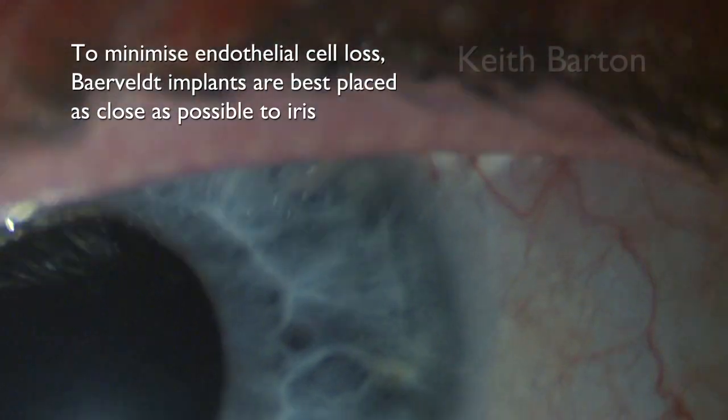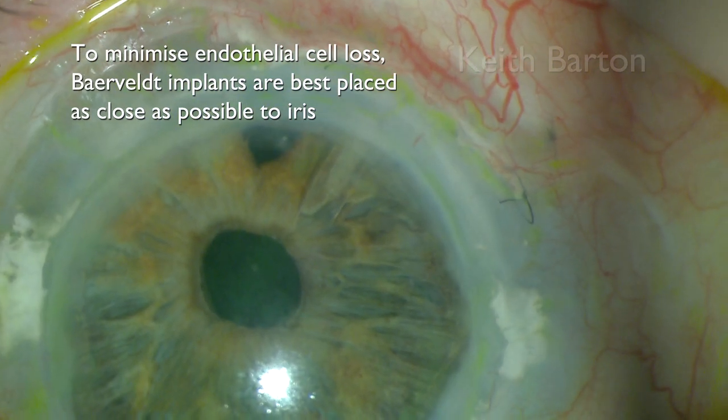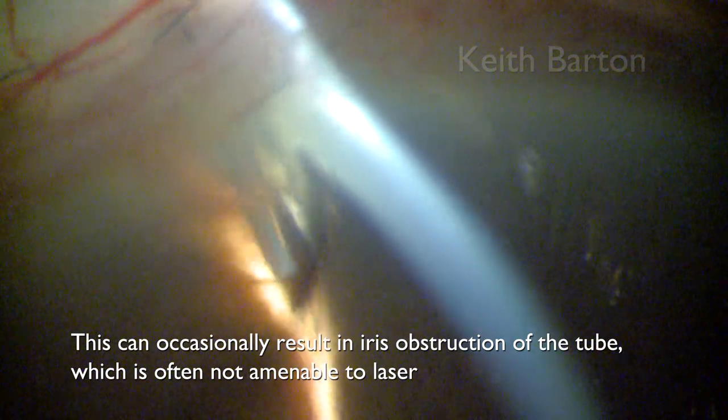To minimise endothelial cell loss, Baerveldt implants are best placed as close as possible to the iris, as seen here. This can occasionally result in iris obstruction of the tube, which is often not amenable to laser treatment.